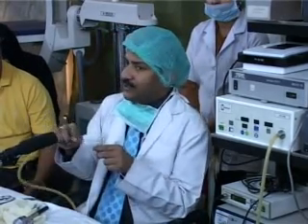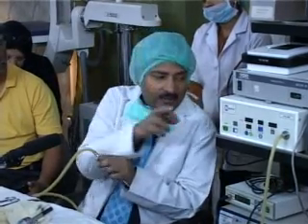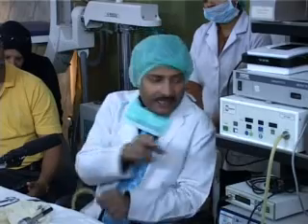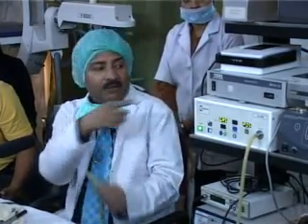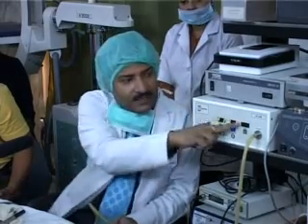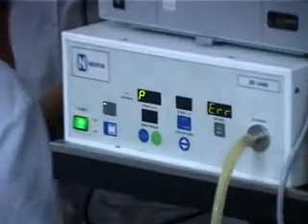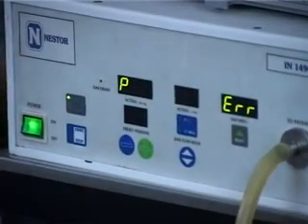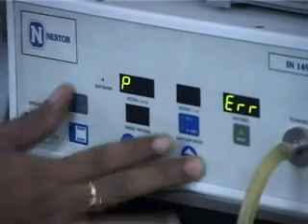What is that safety feature? If you attach the insufflator to the Veress needle and then switch on the insufflator, it will give you an error message. If you see here, it will give you an error. Why error? Because all the switches are blocked. It will not work.